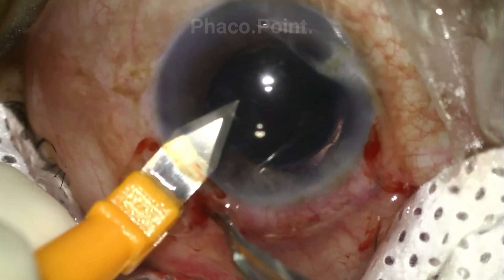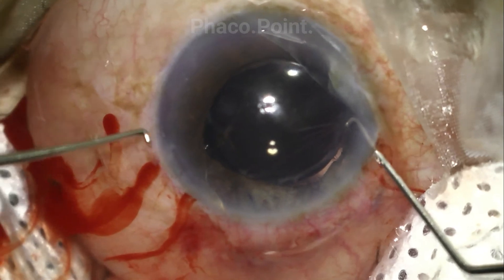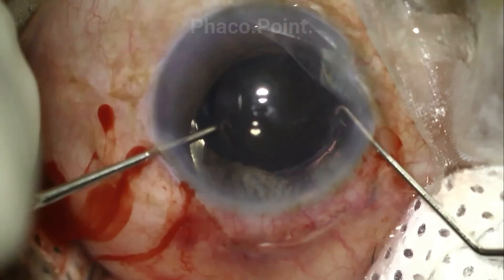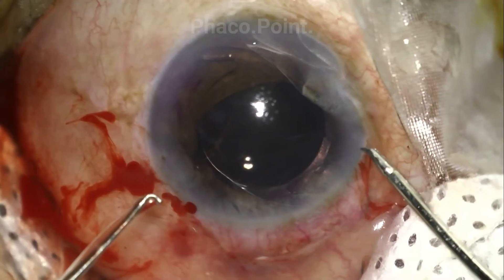The main 2.8 incision is suitably enlarged to allow for ease of explanting of the IOL. The IOL is then rotated such that both haptics come to lie on either side of the main incision.